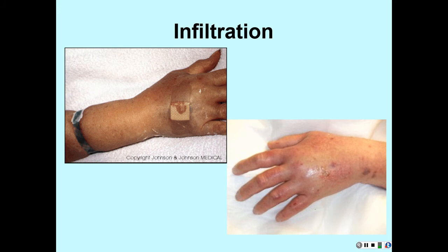No, this is not a sudden. If you puncture the vein when you're starting it, you'll know immediately because it will swell right up at the site. This is not, I've started it and it looks like this. Okay, this has been infiltrated for a little while. This one has too. If you blow the vein when you start the vein, you're going to know immediately because it's going to swell. All right, and I hope you cut it off before it gets to that point. Okay, you'll see that. But these are the kind that have been infiltrated for a little while.